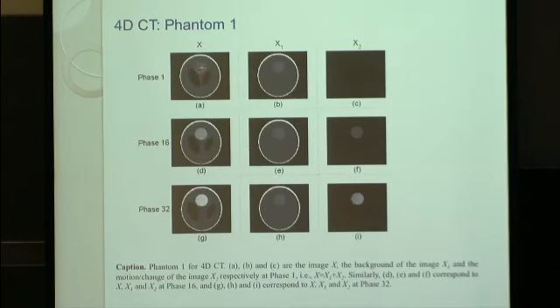The contrast of the big circle here is changing, and so on and so forth. There's motion of these two little things, motion of these two big elliptical shapes, and also the intensity change of this big circle. So basically, if you look at a different time, it's this one stationary background plus these differences, these changes. So this is the real image.